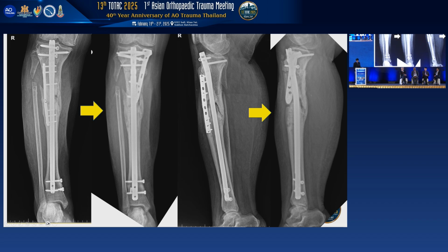So I think it's ready to heal with more stability. For stability of the tibia, the best one is the nail, and reaming also enhances the endosteal healing. For the reaming, yes, I agree that reaming products may help.